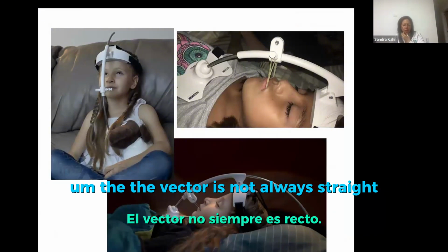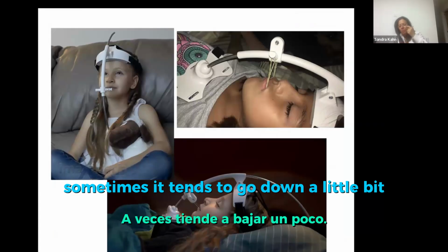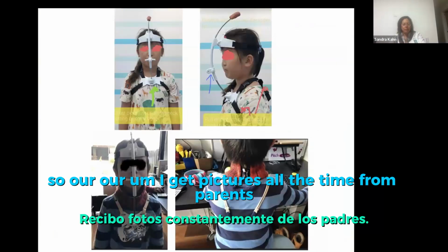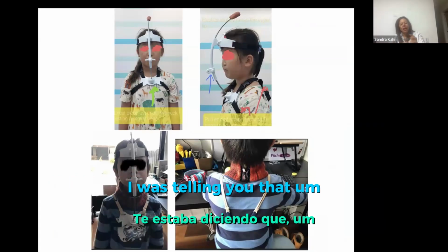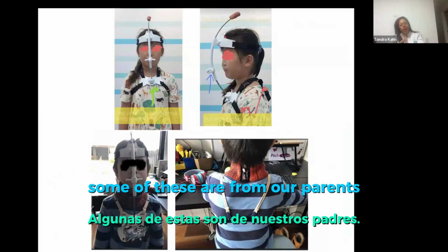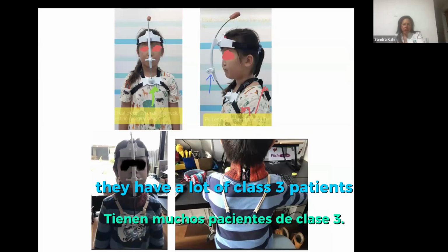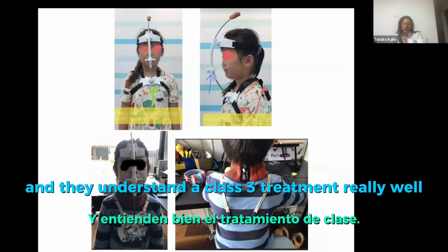The vector is not always straight. Sometimes it tends to go down a little bit, but it's in the general area of straight up. So I get pictures all the time from parents. I was telling you that some of these are from our parents in Korea, South Korea, and we have doctors over there. They have a lot of class 3 patients, and they understand class 3 treatment really well.